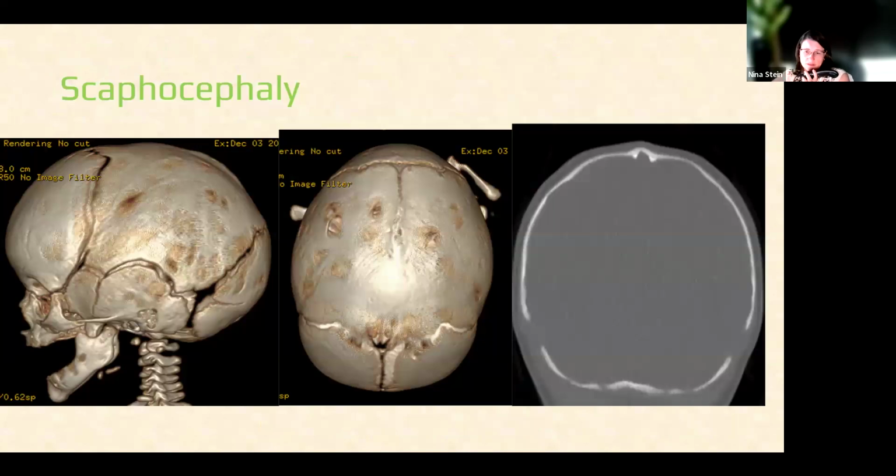So this is, again, another case, but now on a CT, right? So this is what happens in CT. We try to reconstruct a 3D, and we use very low dose. So that's why we have these gaps as well.